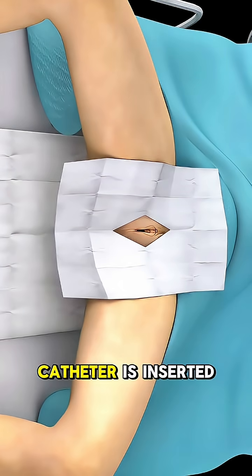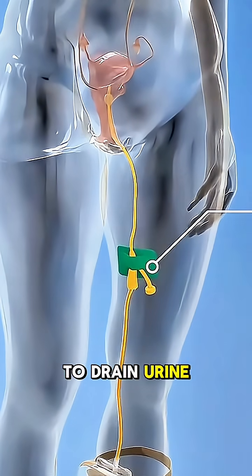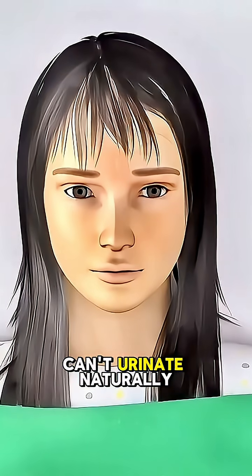Ever wondered how a female Foley catheter is inserted? It's a sterile medical procedure used to drain urine from the bladder when a person can't urinate naturally.